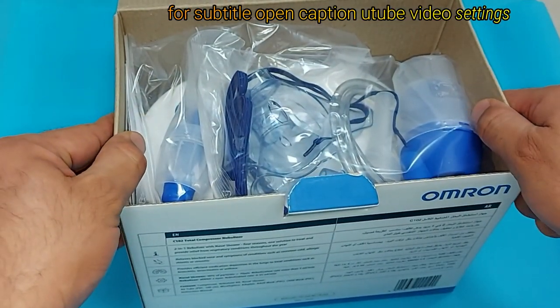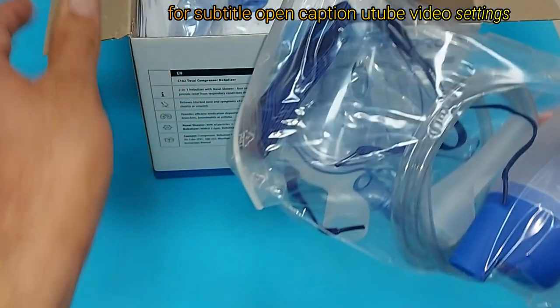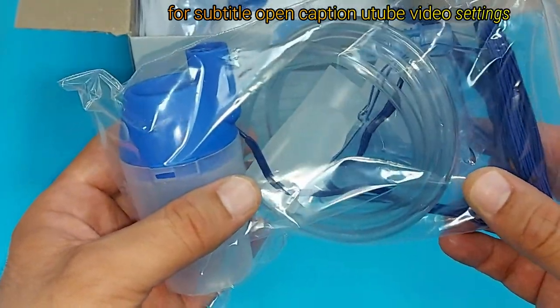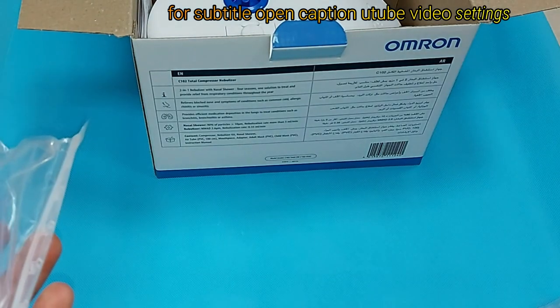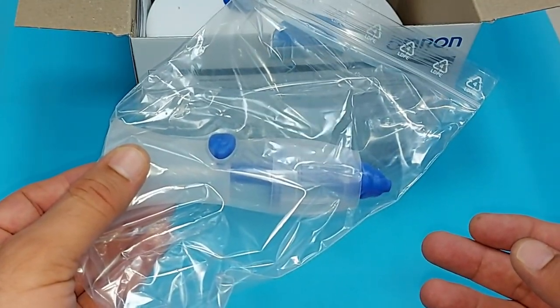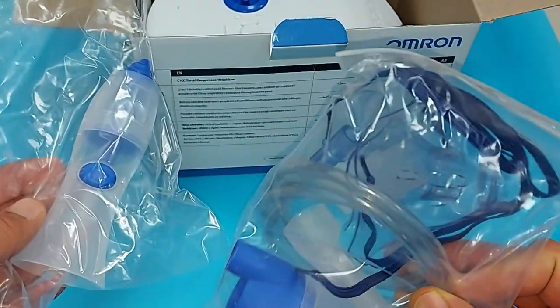When you unbox this device you will find the following items. This is your medication container, and this is the tube which we will connect to the medication container. These are the masks — a pediatric mask and an adult mask. And this is a nasal shower, which is the best item because you can use it for nasal cleaning. I will show you how to use the different masks for nebulization and how to use this one for nasal cleaning.